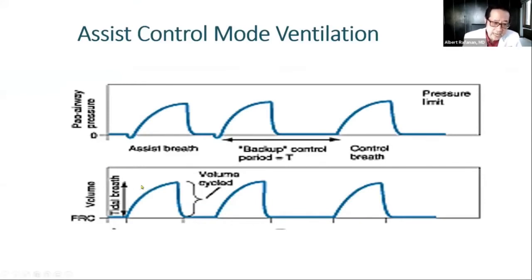So this is a diagram. In this case, this is a patient on assist control. Here, there is an inspiratory effort, a change of flow or a change of pressure. The machine detects a breath, it gives a breath. This is assist control. Here, the machine again detects a breath, it gives a breath. So for every effort, the machine gives a breath.